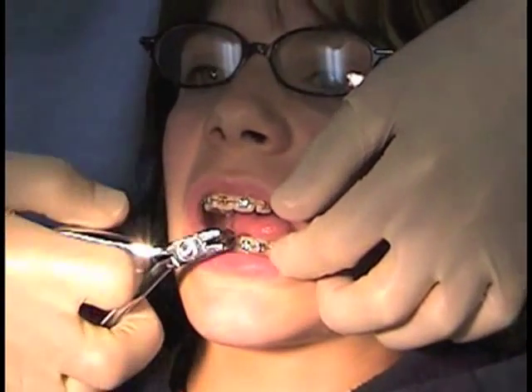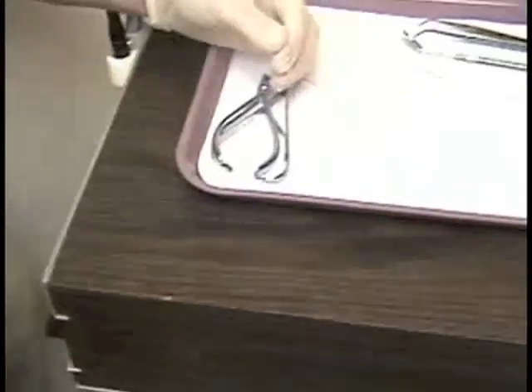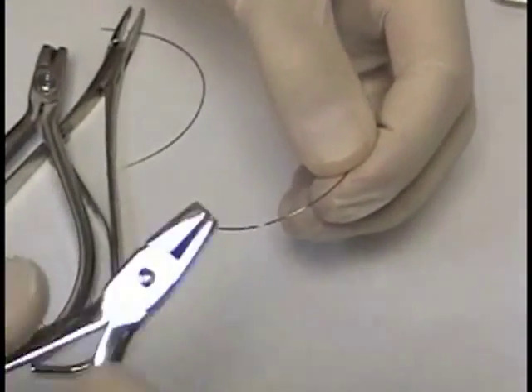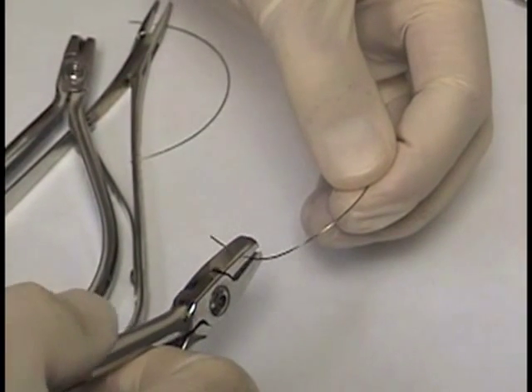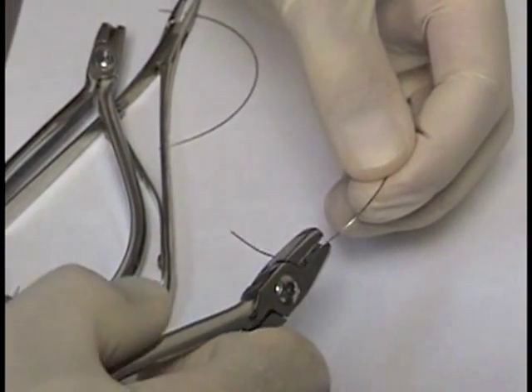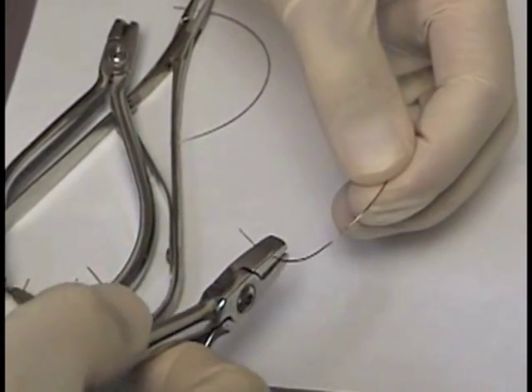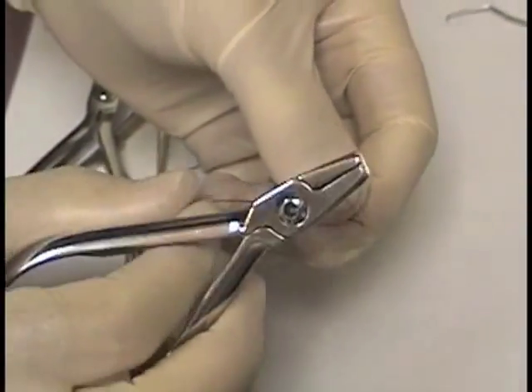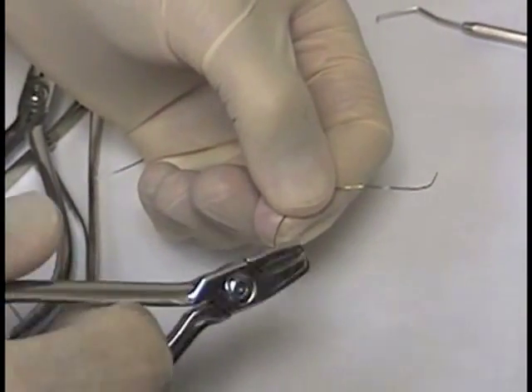Now we're ready to place the curve in the arch wire. We take the wire out and over to the bracket table using a chop plier, starting at the canine. This is an 016 stainless steel wire. Remember on the 016, the way we measure the curves is when the wire sits passively in the mouth, the front part of the wire is going to be about 8mm into the vestibule. If this was an 014 stainless steel it would be about 12mm. If it was an 020 it would be about 4mm. So the heavier the wire, the less curve you use.